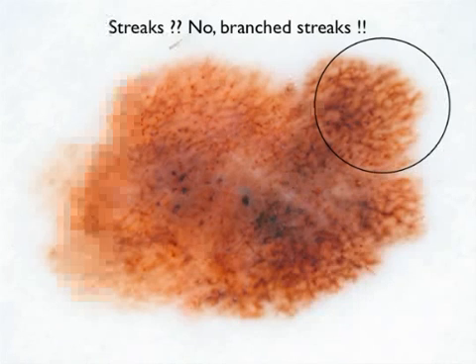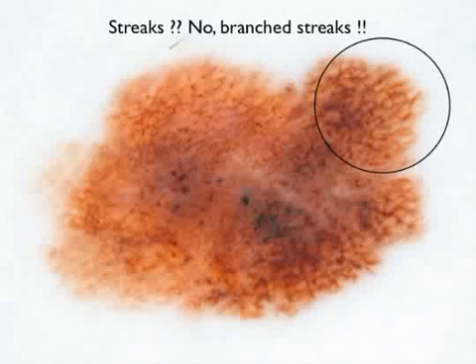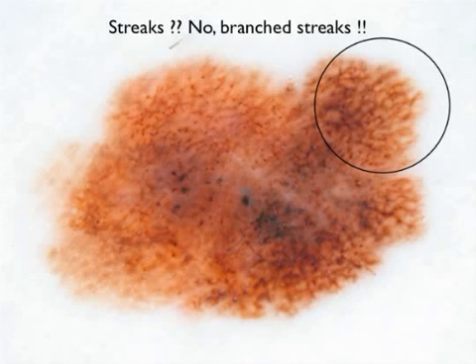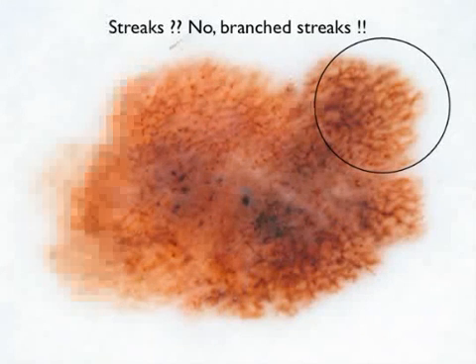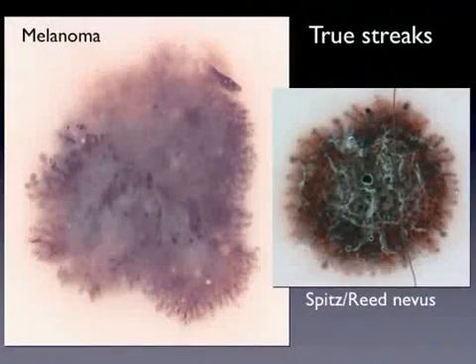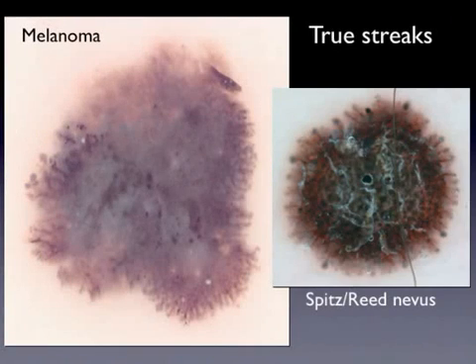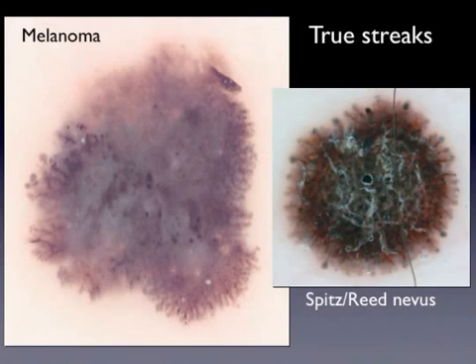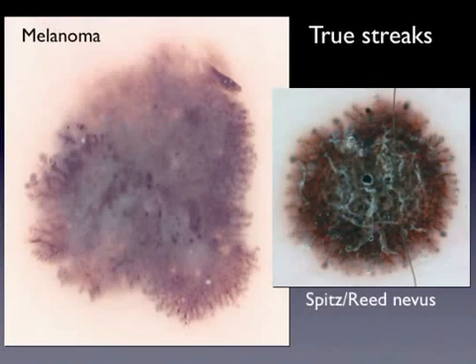The next melanoma-specific feature is streaks. They should not be confused with branched streaks, which represent only the abrupt peripheral cut-off of an atypical network, as shown in this melanoma. Streaks are defined as peripheral, pigmented, linear or bulbous projections, usually seen as a dermoscopic sign of growth of the lesion. They can be seen in melanoma and Spitz or Reed nevi, with an asymmetric or symmetric distribution around the lesion, respectively.